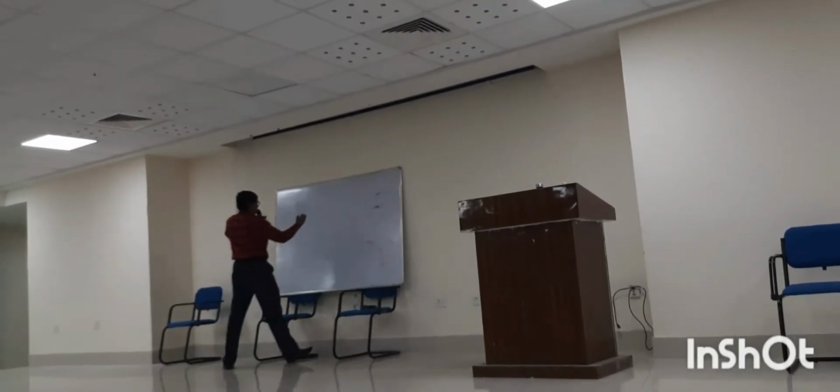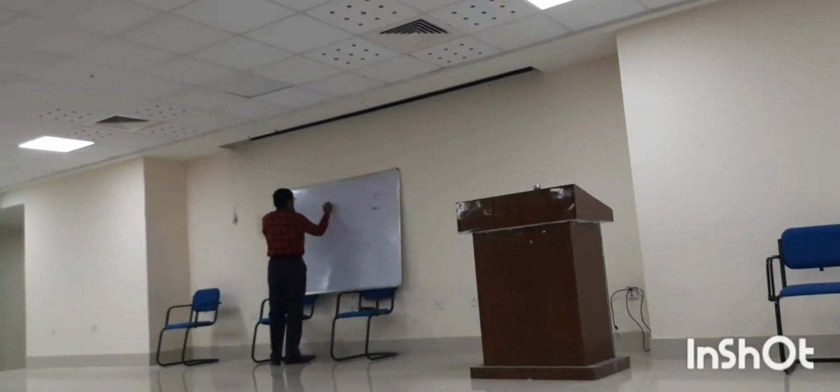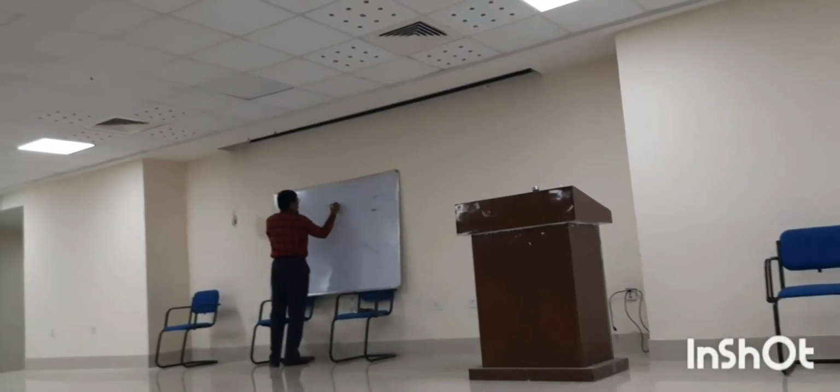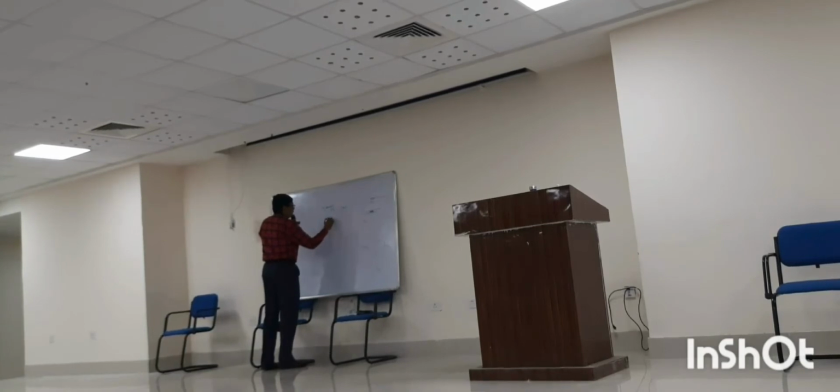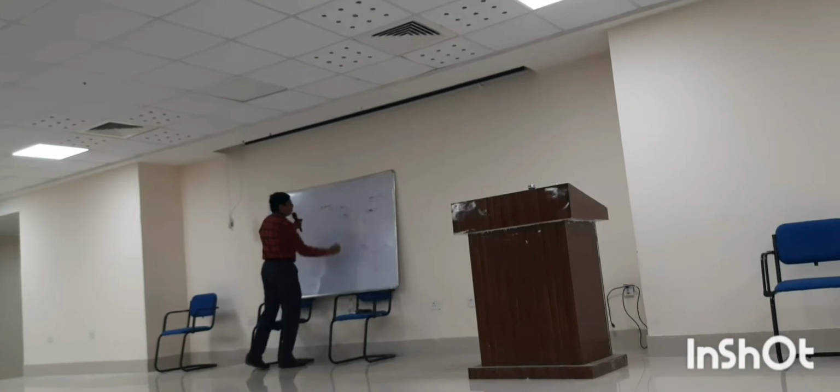So, ten small squares is equal to 1 millivolt. So, one small square is 0.1 millivolt.